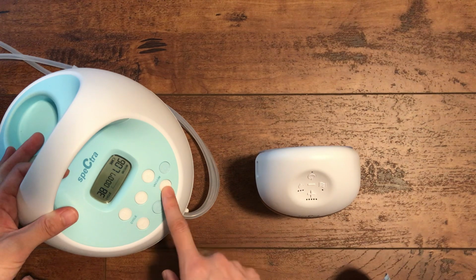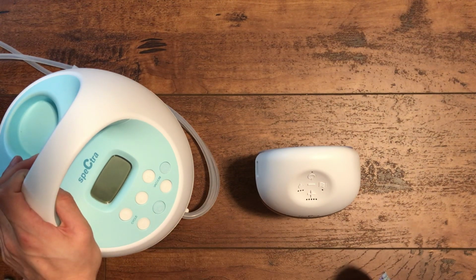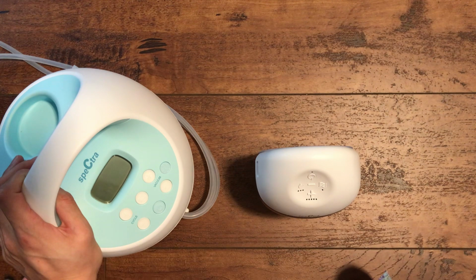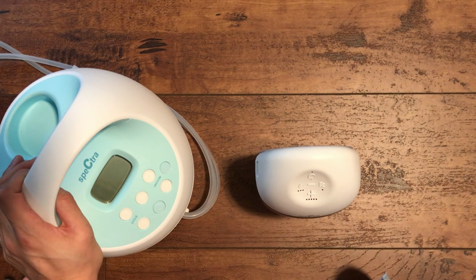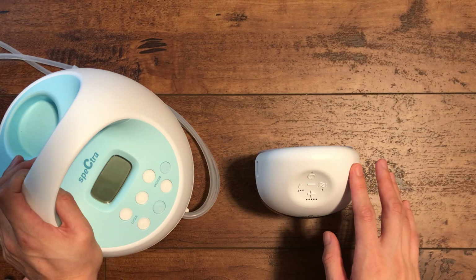Yes. My go-to level is level 5 with the S1. So that's in the middle. I don't think there's any equivalence between the two. It's very different because that has 12 levels and this only has 5. You can't really say, oh, if you use level 5 on this one, you have to go to level 3 here. You can't really compare. It's an apples to oranges comparison. So I would suggest playing around with this pump and seeing what's most comfortable for you.